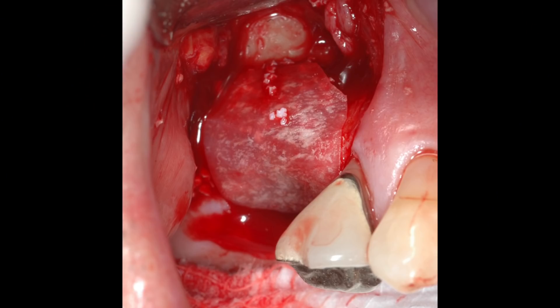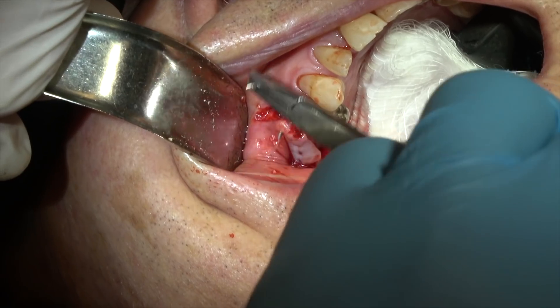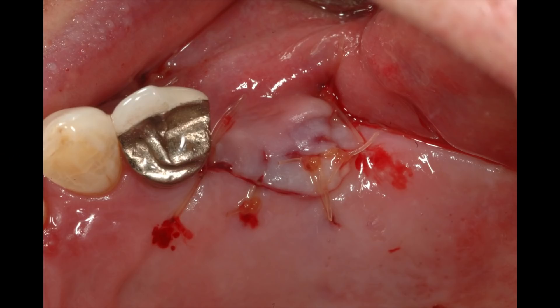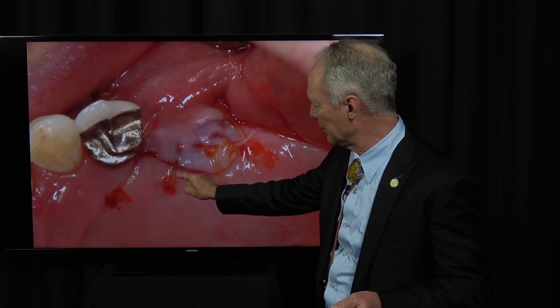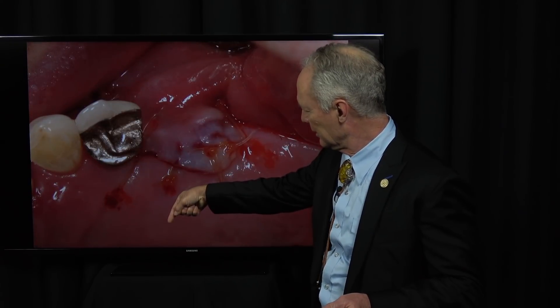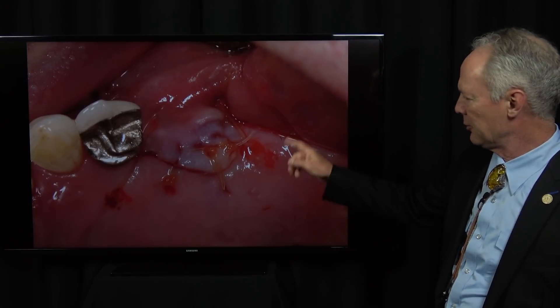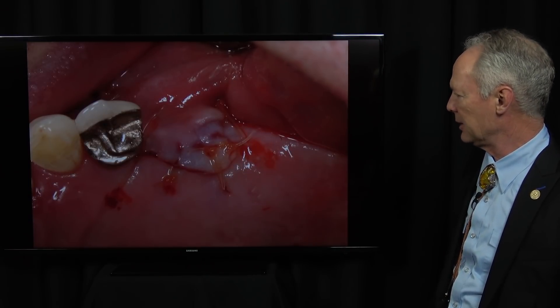You can see I've completely covered the dehiscence over the implant. I'm suturing with gut suture using interrupted sutures — sutured snugly with no blanching on the surgical site. You want to take a deep bite with your suture — don't just barely go through the edges. Go far into the flap and the adjacent tissue you're suturing to so the suture does not pull through.